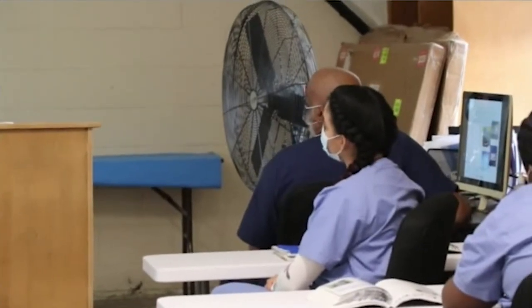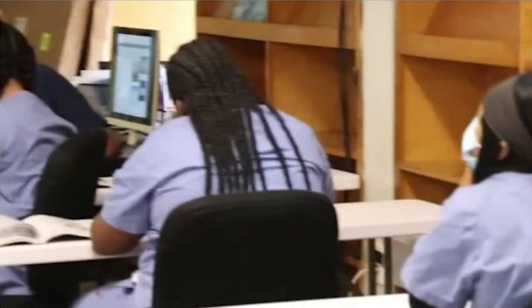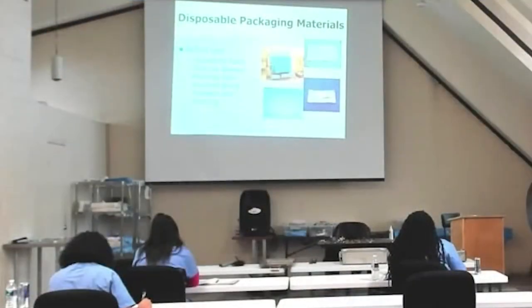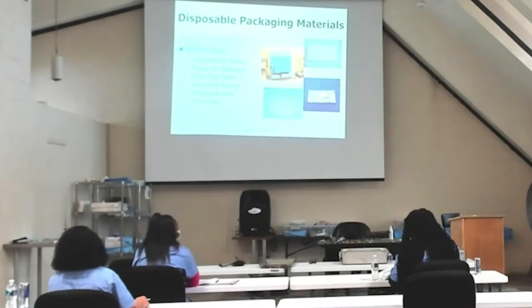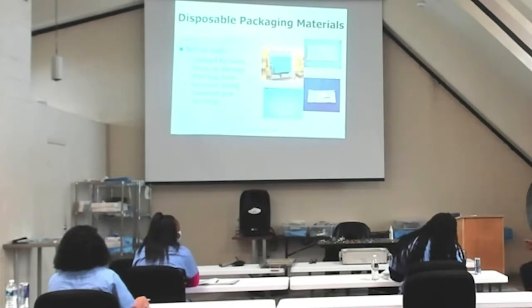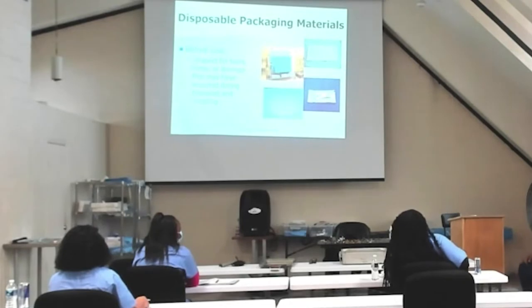So there are materials that are allowed to go in your trays and not contaminate them. These are all considered disposables, by the way. We're going to use them one time. We're always inspecting for tears, holes, and damage. And one more thing, the expiration date. Okay. Now that filter that you see is a round filter because remember, some of our systems are universal, meaning it could be round, it could be square, just like these, right?